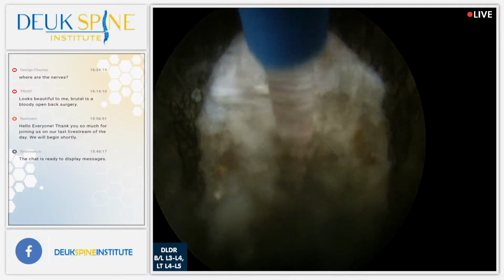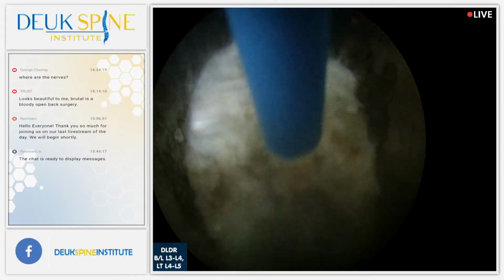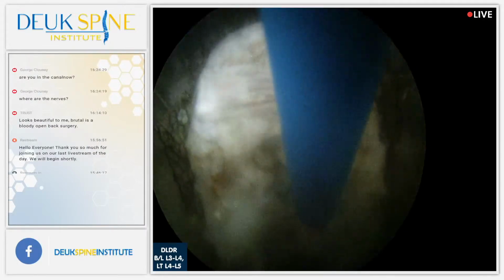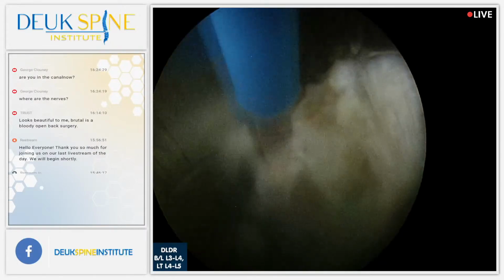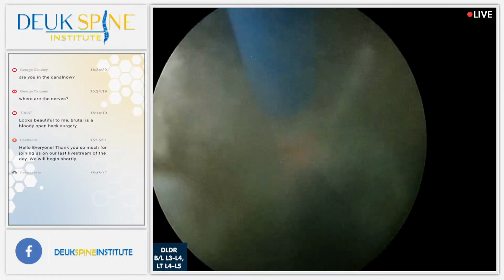No, it's weird. All right, I can't turn it. It's too much. It's too much pushy. It's actually having an opposite effect of forcing it the other way. That's fine.